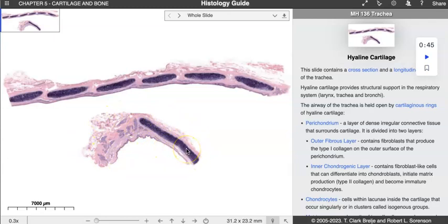Your slide actually is the tracheoesophageal slide, and so you have two different rings of tissue on the slide. I usually say to students, put the slide on a piece of white paper and just with the naked eye, look at what you're seeing. You should see these two rings, and one is going to have a much more circular nature to it. They both are circles because one's the trachea and one is the esophagus, but you have to identify which one is which. And then you have connective tissue that's going to join the two of them together.